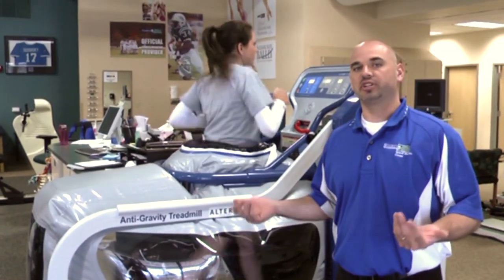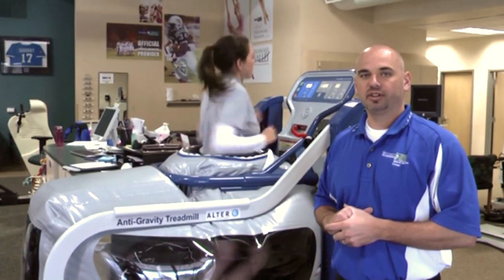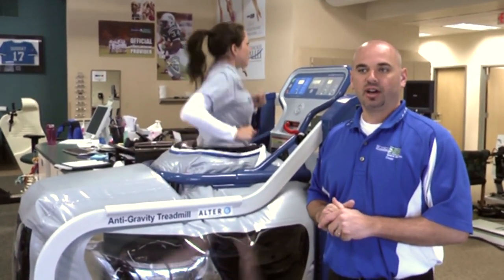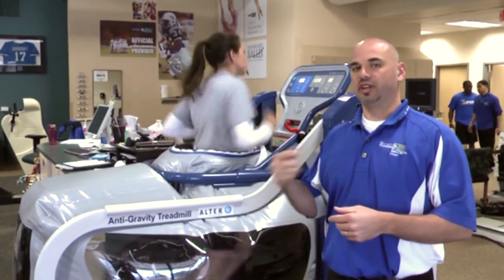We can go from a walking to a jogging to a sprinting pace, and this will take some of her body weight off. We are also able to do some overspeed training with this, allowing the patient to go faster than they normally would feel comfortable going.